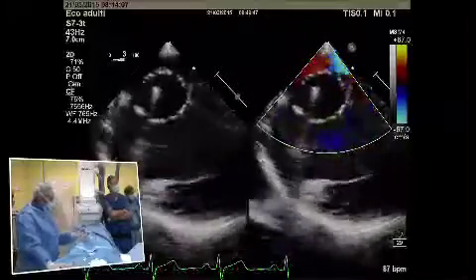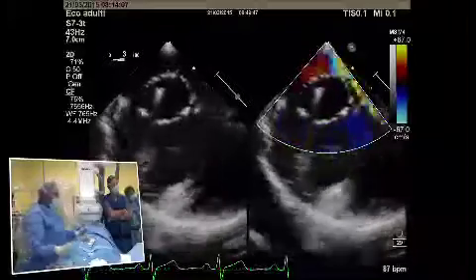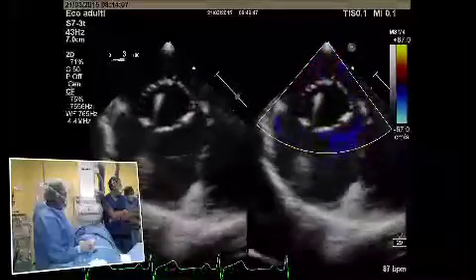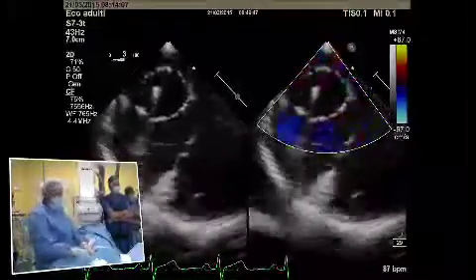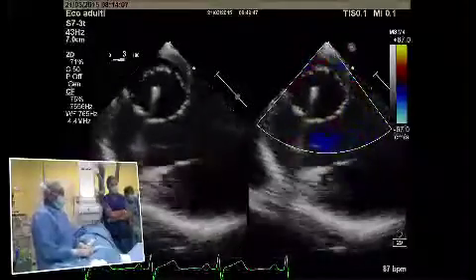This is a very nice case anyway. Well, we're going to use an Amplatzer ASD occluder. Aki, what size would you suggest? I go for 16. Yeah, Aki is suggesting 16. What about a 16 millimeter ASD occluder?